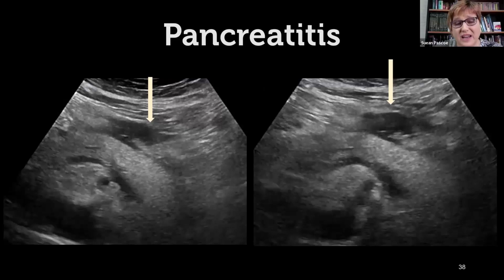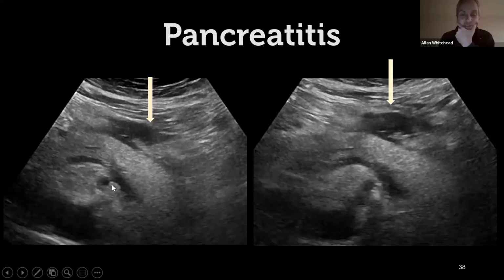I don't know that just looking at it you can really say. I think most of the pancreas is retroperitoneal. I think I set up the front there. So it may be, but I don't know just looking at it that we can be really distinct about retro or intra, because you can get ascites with pancreatitis as well.